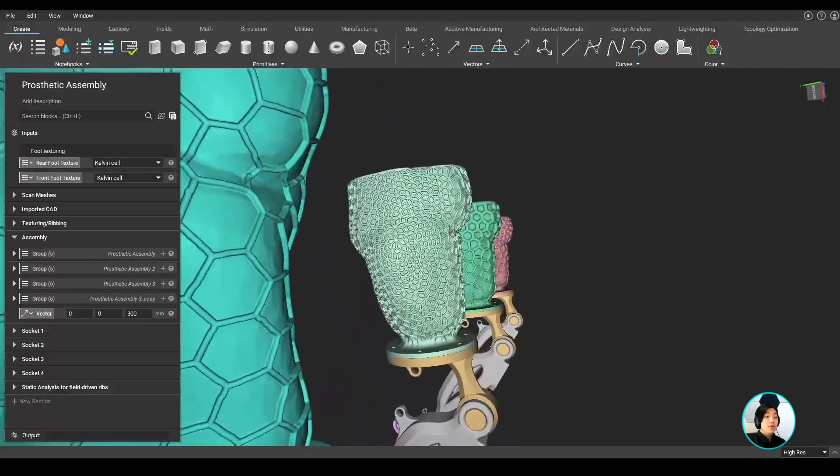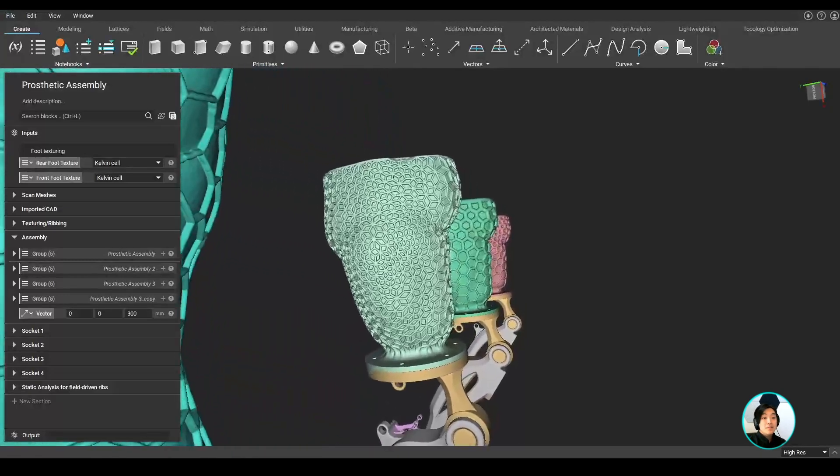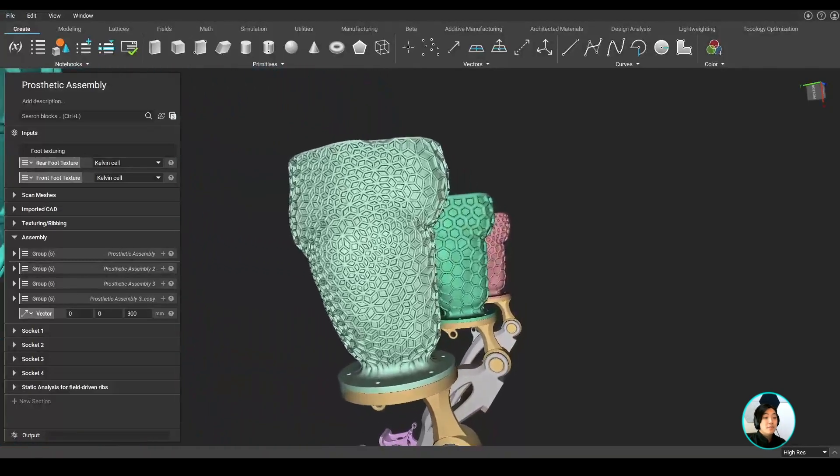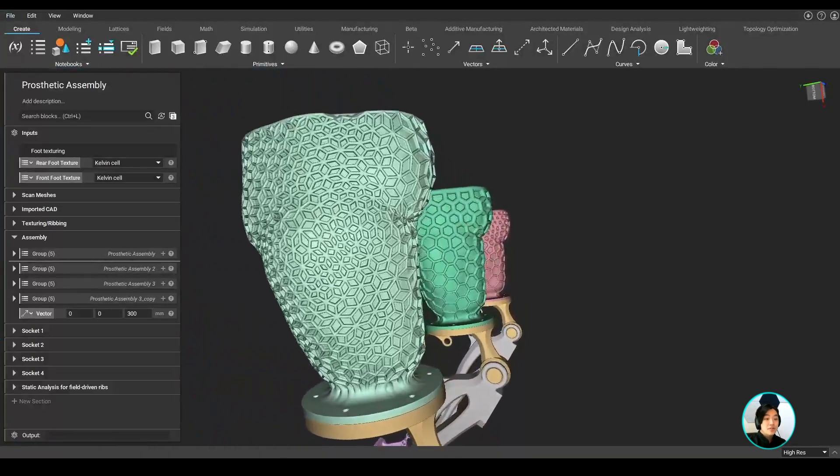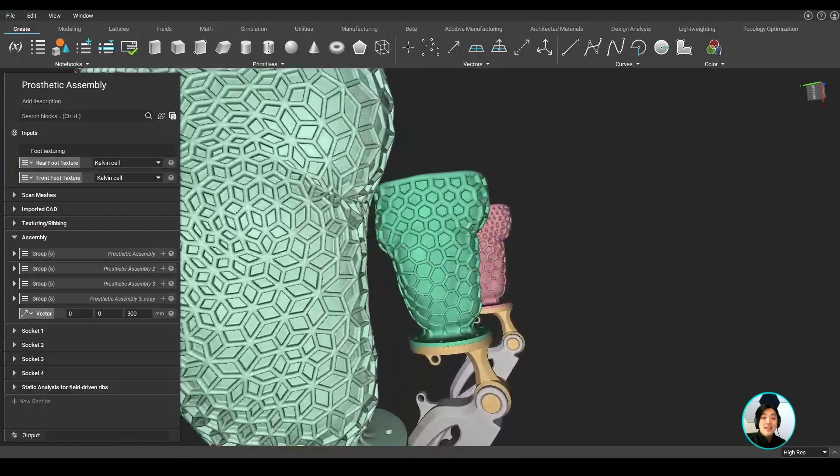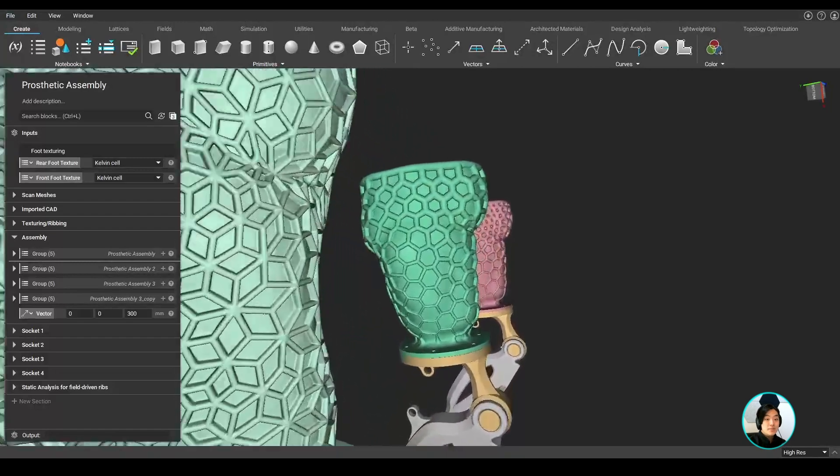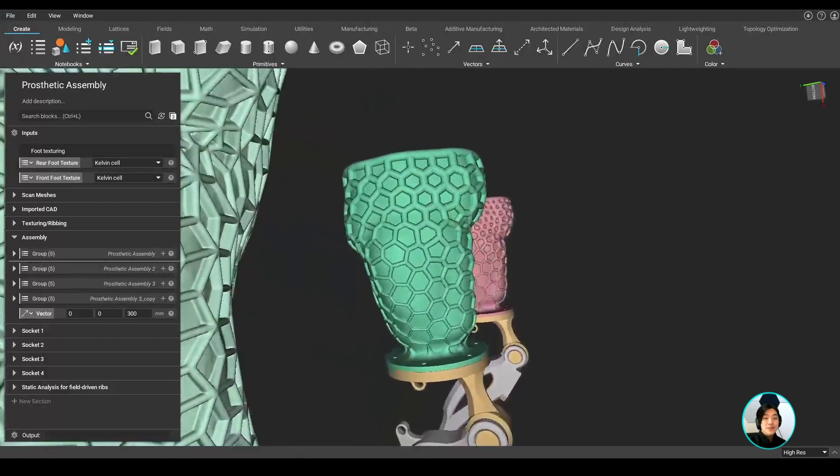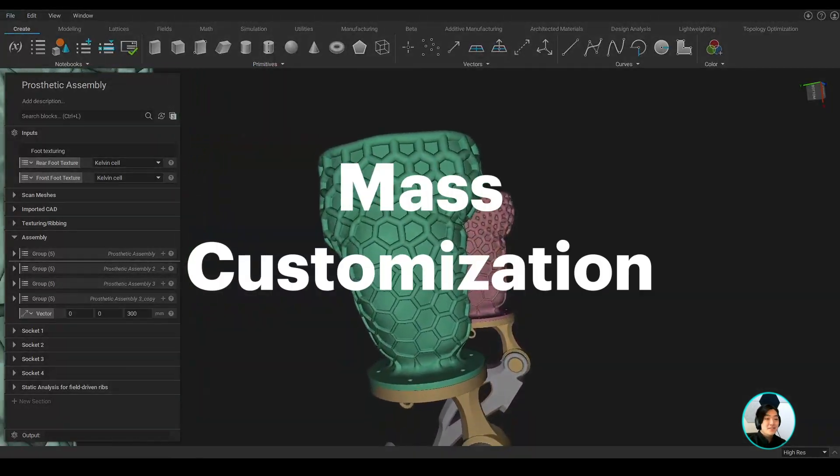In nTopology, you can build automated design processes to manufacture personalized products at a cost and quality comparable to mass production. We call this mass customization.